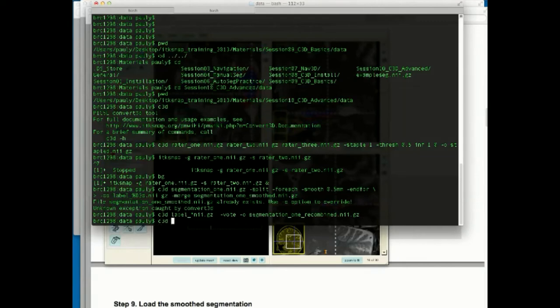Okay, so I'm just going to go through this. Load the gray image, which we already have loaded in ITK-SNAP. Next thing I'm going to do is just massage this image so it looks better. This is also important for publication, and Paul showed you in the morning how you do it in ITK-SNAP. You drag those curves in the contrast window to make sure the contrast looks right, that kind of stuff.